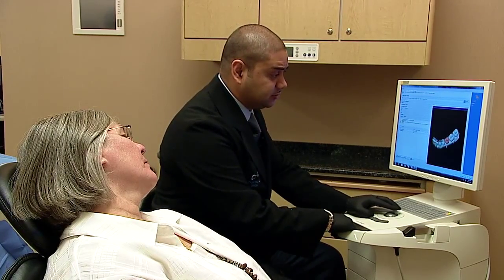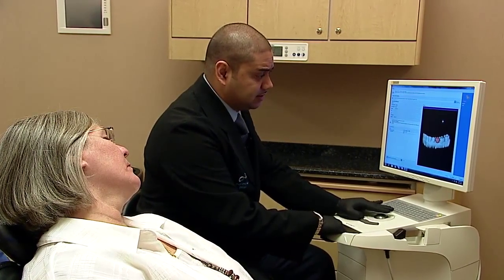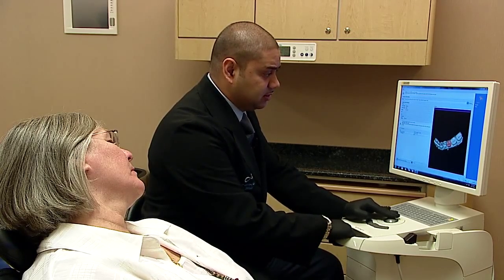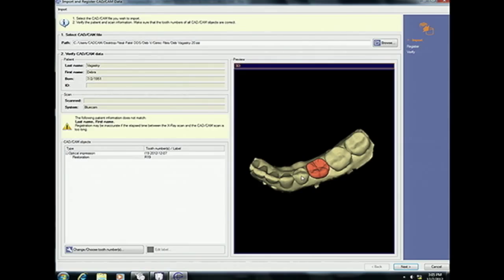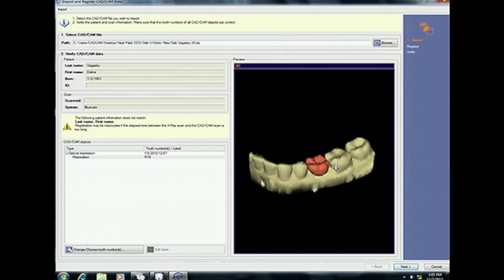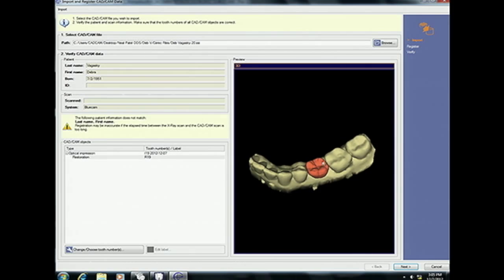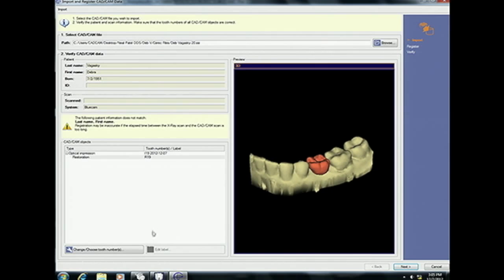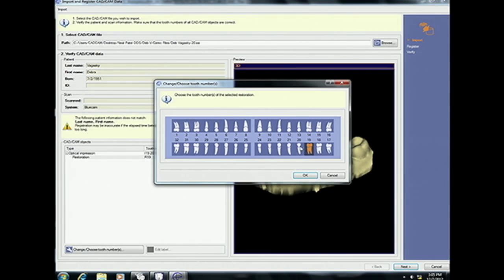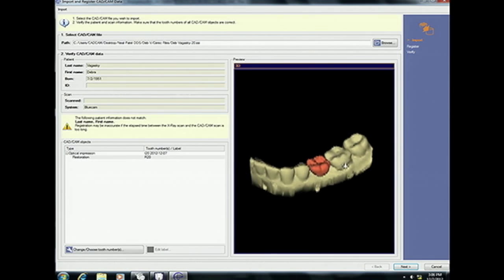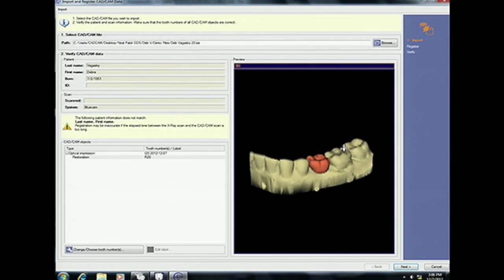You had a pediatric tooth, a baby tooth, that was there that needed to come out. That baby tooth happens to be much larger than the premolar that you were missing. So in the software, the tooth was labeled as 19 so that CEREC can actually design the appropriately shaped tooth for that edentulous site. We can relabel that for numbering and documentation purposes to tooth number 20, which is really what tooth we're replacing for Deb.